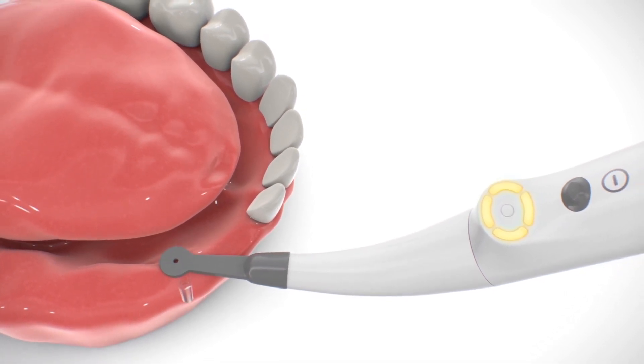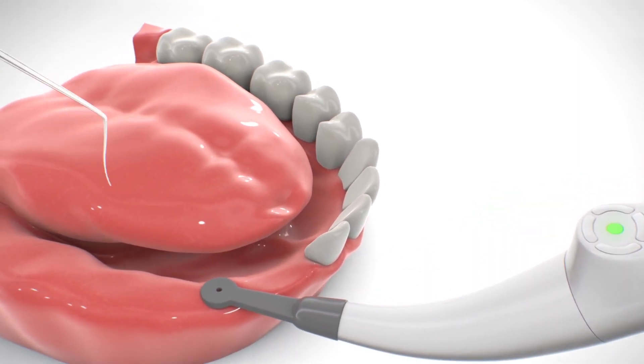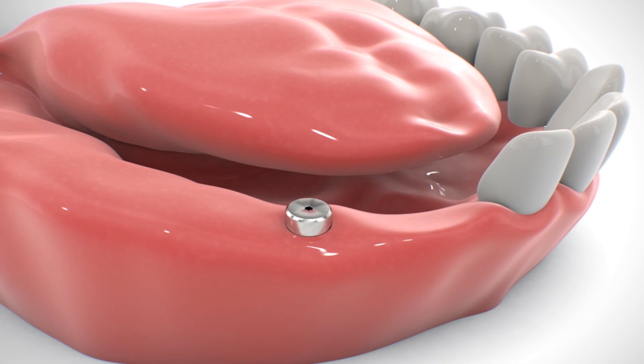Perform additional cross-scanning in a cross-direction until the central dot turns green again. Using a dental probe, mark on the gum the implant position through the hole in the middle of the sensor.